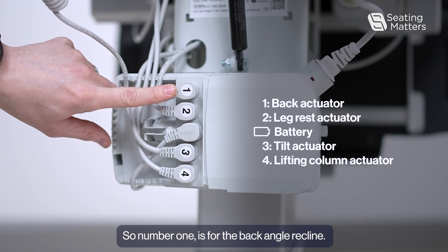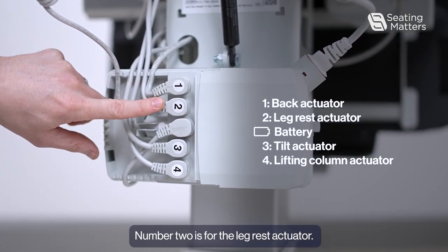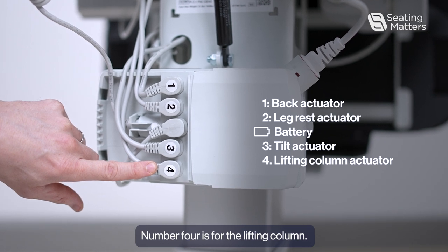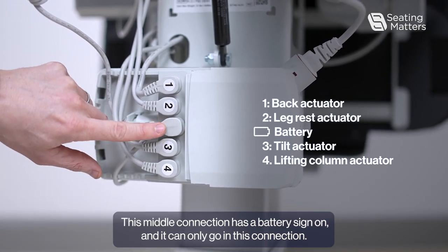Number one is for the back angle recline, number two is for the leg rest actuator, number three is for the tilt and space actuator, and number four is for the lifting column. This middle connection has a battery sign on, and it can only go on this connection.